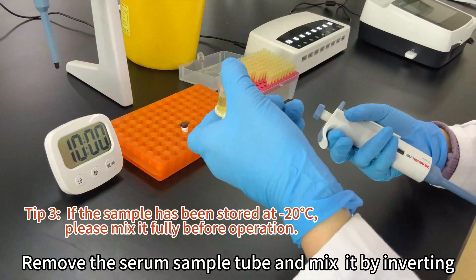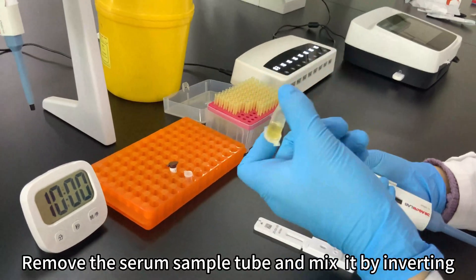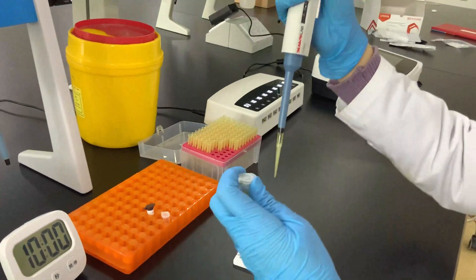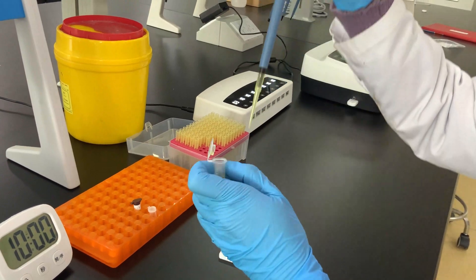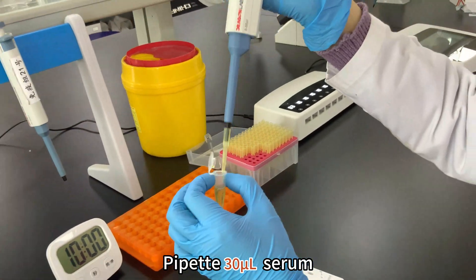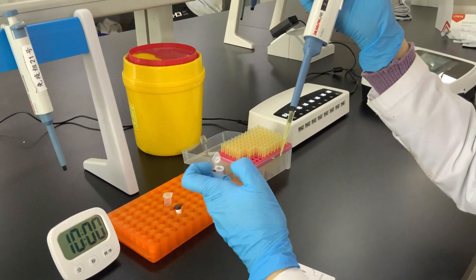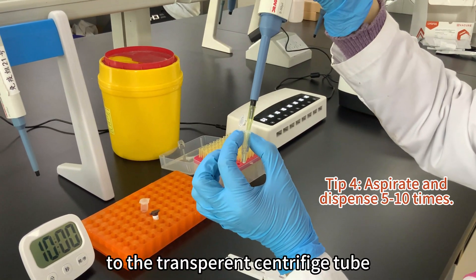Remove the serum sample tube and mix it by inverting. Pipette 30 microliter serum to the transparent centrifuge tube.